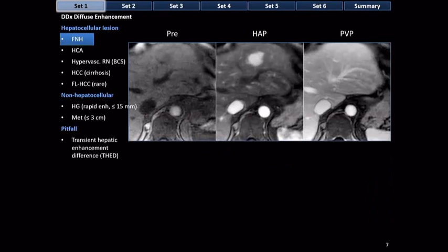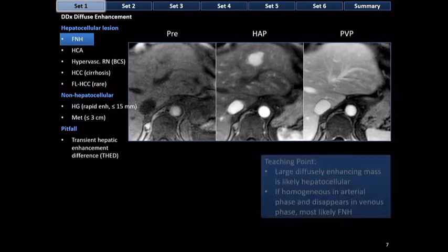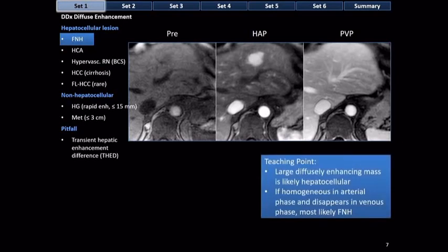Focal nodular hyperplasia does occur in men, though less commonly than in women. Here is an MRI example of a diffusely hyperenhancing mass that disappears in the portal venous phase. In the absence of cirrhosis, diffuse enhancement with portal venous disappearance favors FNH — the same teaching points as before. You can't say with 100% certainty based on these images alone, but you can suggest it.